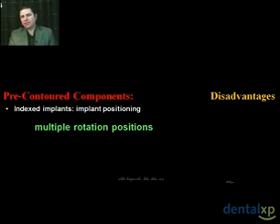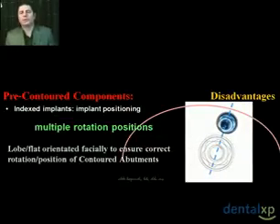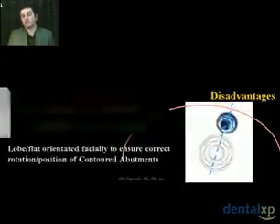You can tell the materials are different, but the contours are identical. One of the main disadvantages with this system relates to the surgical placement of the actual implant. Implants are generally indexed. They either have internal hex or external hex, so 6 surfaces, 6 positions to place the implant, or internal lobes, 3 lobes or 6 lobes. The lobe of the implant or the flat of the hex, whether it be internal or external, needs to be positioned tangent to the curvature of the arch. If not, these contoured components cannot be utilized as designed.